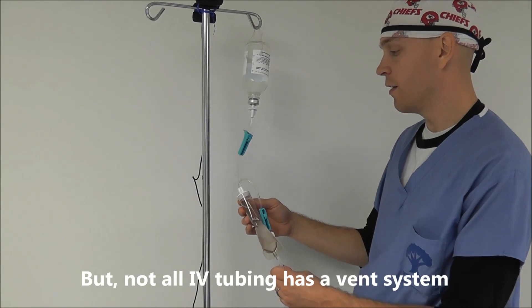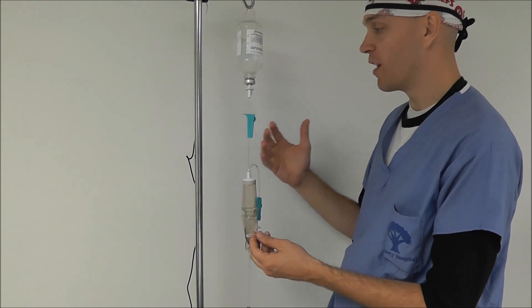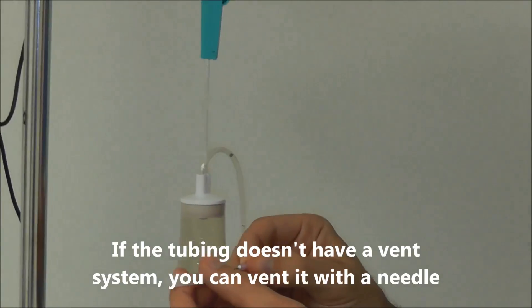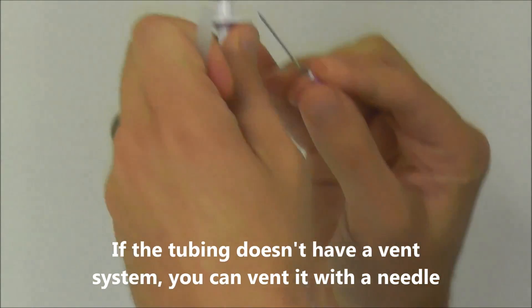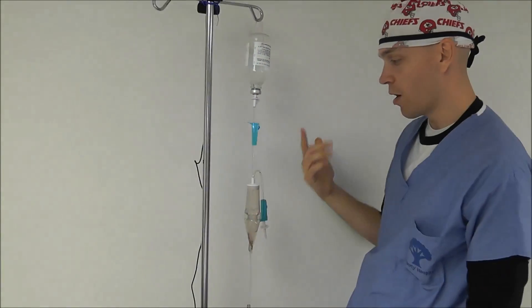When using tubing that does not have a built-in vent system — like blood tubing — you have to vent the system with a needle to get fluid from a glass container to run. You grab a regular needle, bend it slightly, and then as soon as you insert it into the port, the fluid will now run.